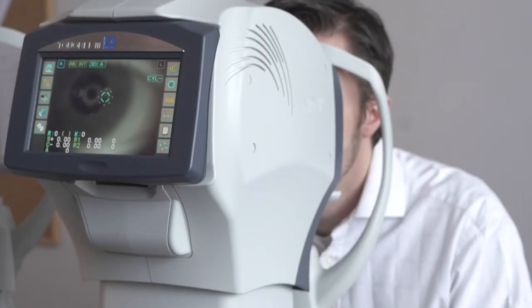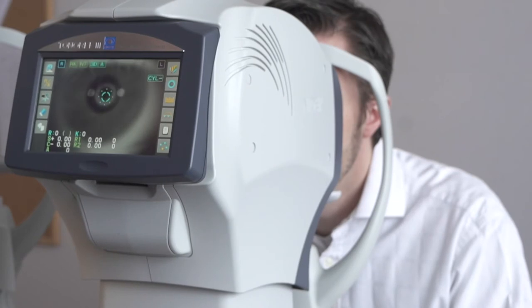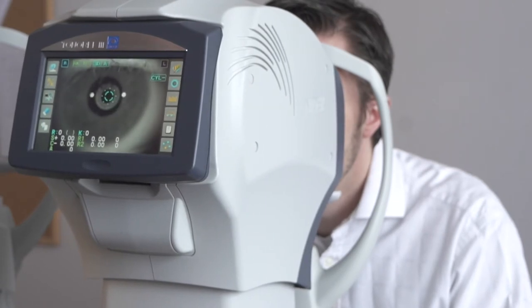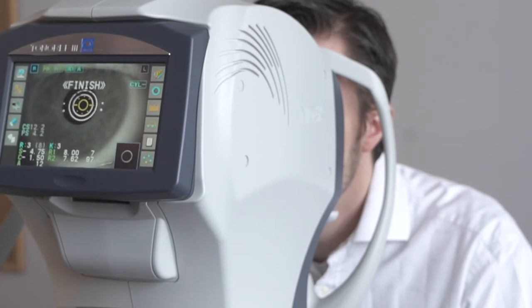Once I'm happy, I'm going to use the joystick to line up with the center of the patient's pupil, moving forward until we get little yellow dots. The patient's going to see an image of a hot air balloon. I'm going to get them to look straight ahead towards the hot air balloon while we take our autorefraction and keratometry measurement.